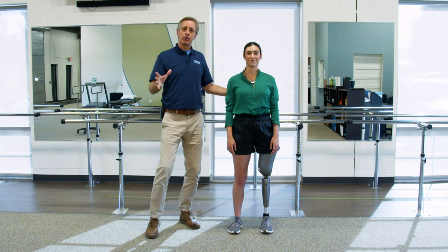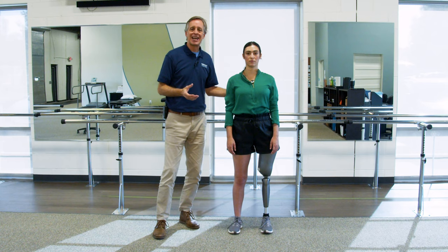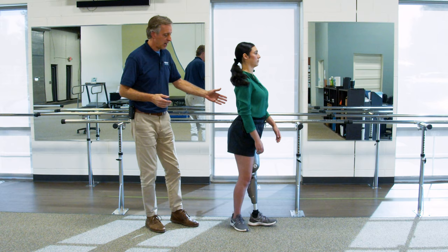Okay, so when we come outside the parallel bars, as your patient starts to feel more confident, or as the patient, you start feeling more confident, you want to get out into a more open area, where again, you can challenge yourself with the exact same basic drills. So, Tracy, if you don't mind, just turn facing away from me, and we're just going to walk a little bit. We're going to take a couple of steps.